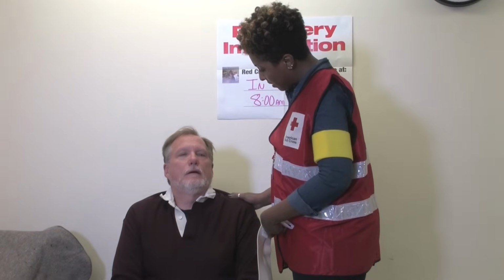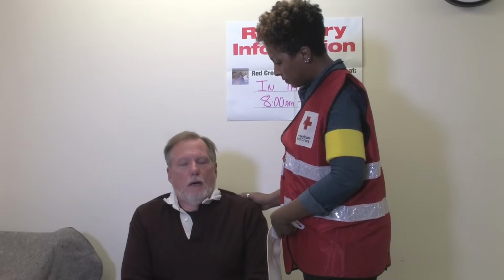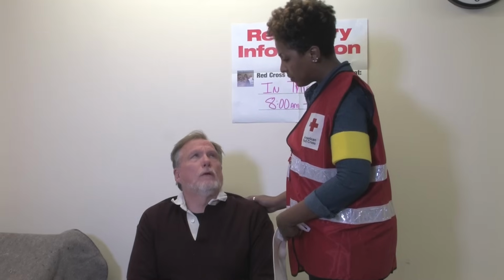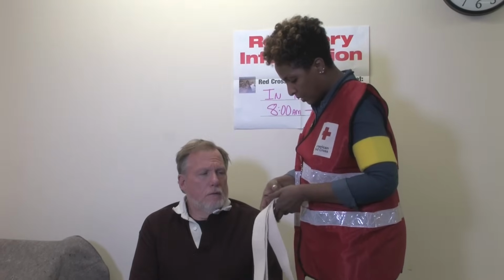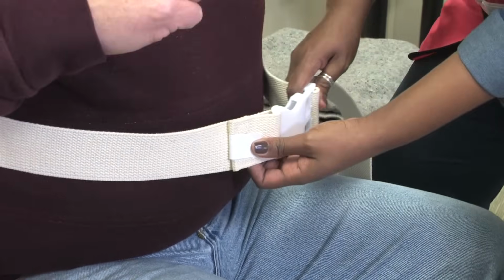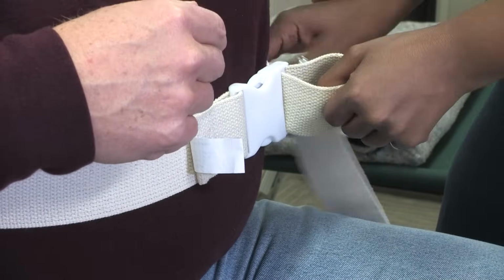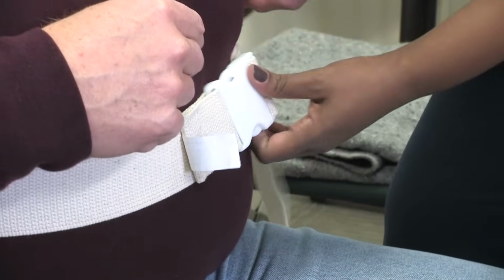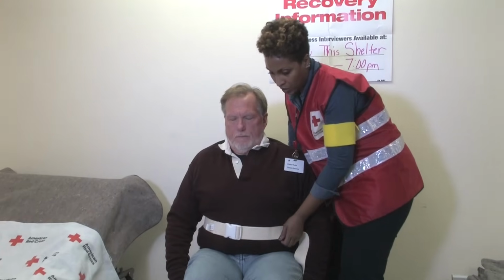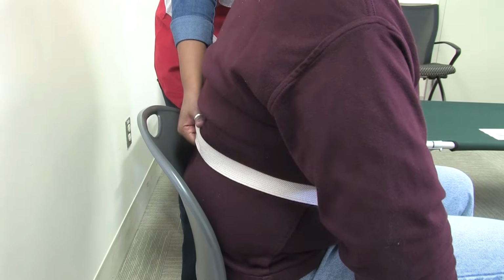Hello. Hi. I'm Keisha. Hi, Keisha. I hear that you're ready for dinner. Yes, I'm really hungry right now. Do you need any special assistance? It would be nice. I'm a little wobbly right now from walking. Well, I can support you using this belt. Okay. And I'm going to tighten this to secure it just a little bit. How's that feel? And we're going to get up on the count of 3. Okay. I want you to plant your feet shoulder width apart. Okay. 1, 2, 3.